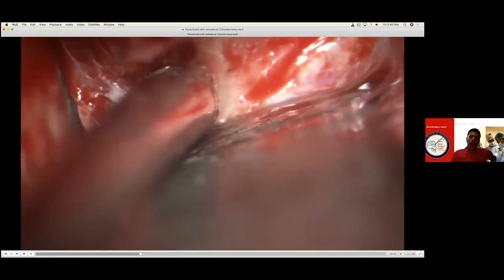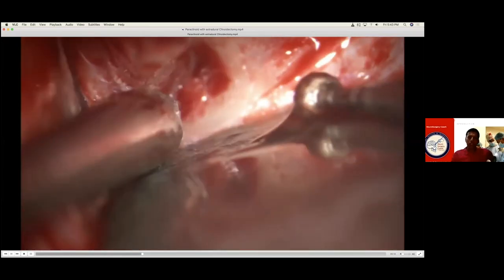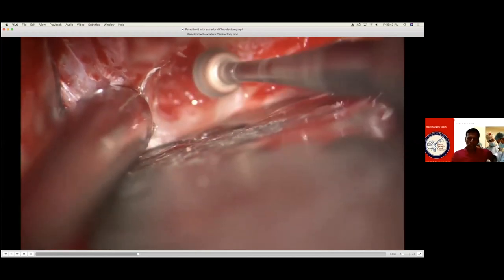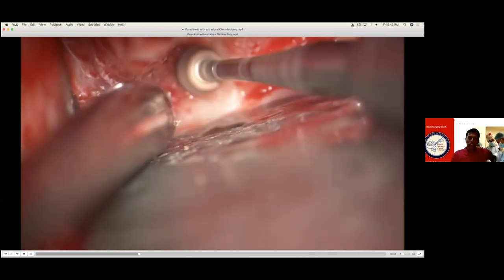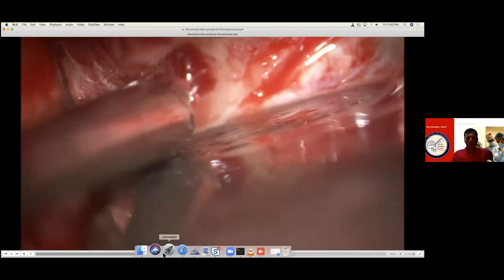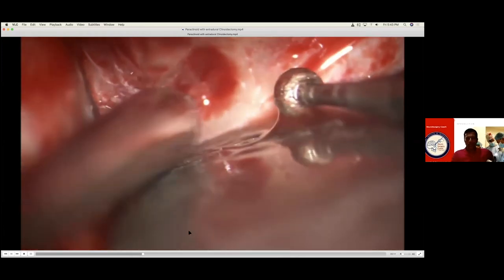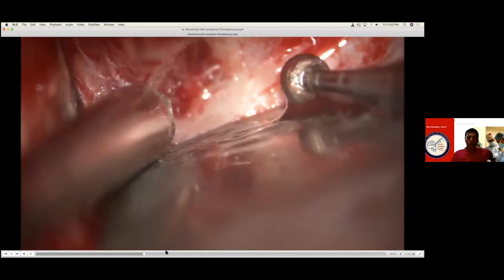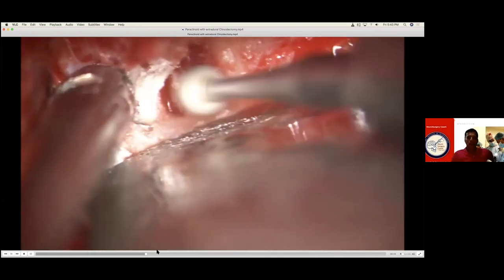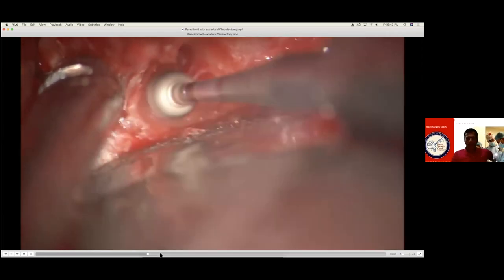Under very high magnification, we are drilling the clinoid away completely. Your clinoid is being drilled at very high magnification. This I call it painting — not drilling, painting. At very high speed, there will be no torque at all when you touch. What I do is I go near the structure, increase the speed to the maximum, and then touch. You're just touching, painting it — taking layers of the clinoid away. You must understand you have the dura there, so your aneurysm is protected by the dura. Not drilling it off — painting it off. You cannot drill in this area with the aneurysm right underneath. If you drill, you have trouble.